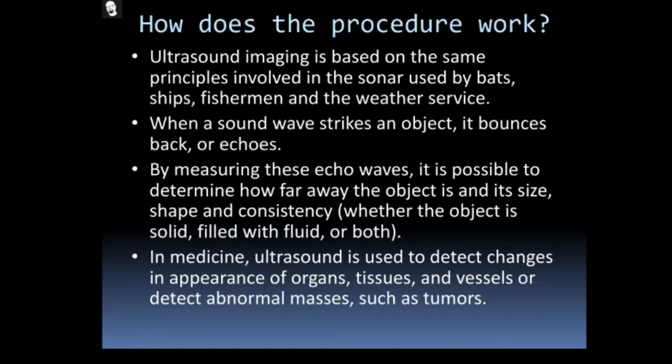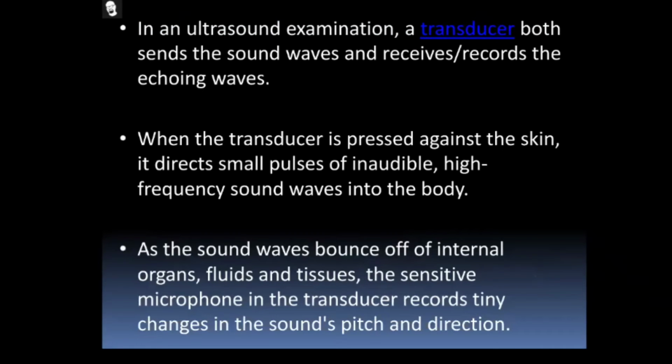In medicine, ultrasound is used to detect changes in the appearance of organs, tissues, and vessels, or to detect abnormal masses such as tumors. I will show some demo once you have crossed over, if time permits. In an ultrasound examination, a transducer both sends the sound waves and receives and records the echoing waves. That's the repeated point: the transducer has the capability of sending and receiving the sound waves.